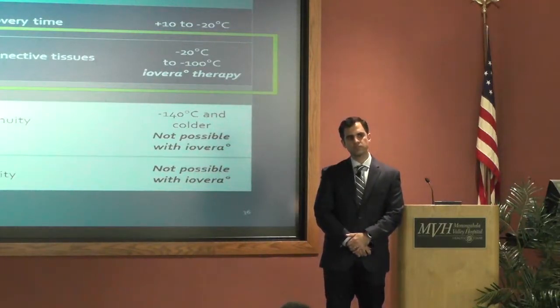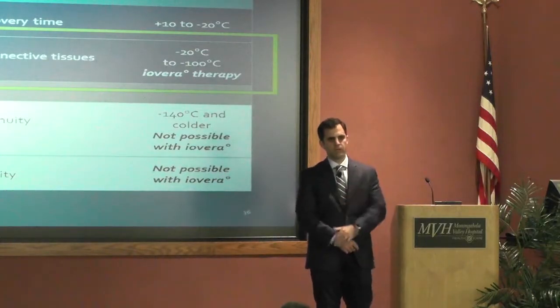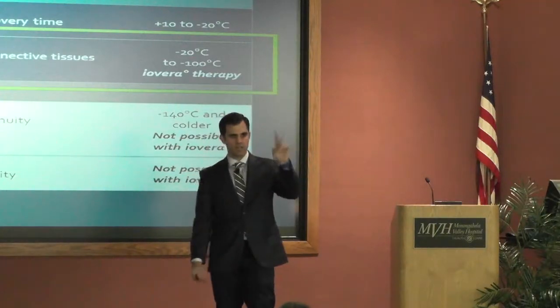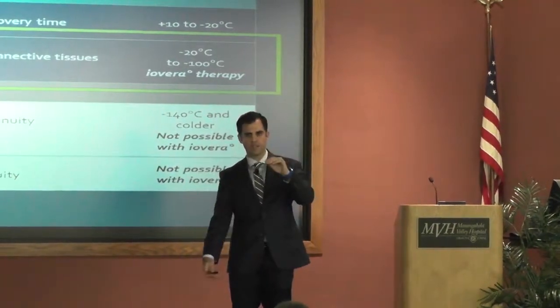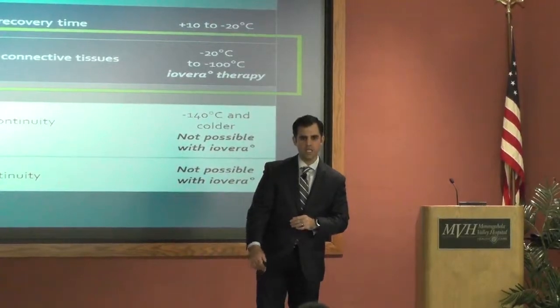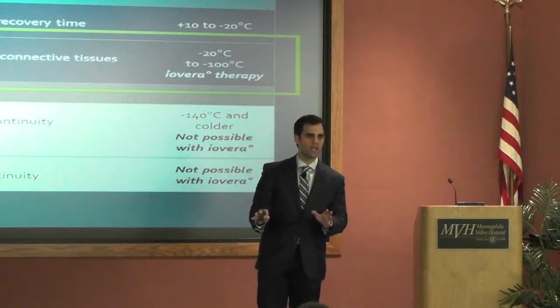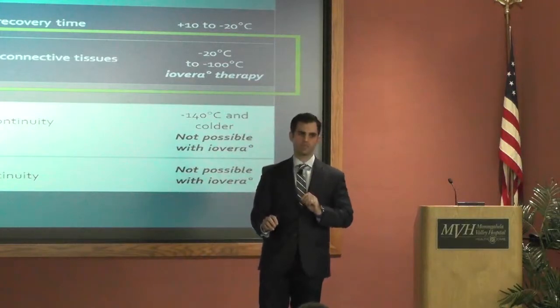When you do this treatment, does everybody get it injected in the same spot? You don't move it around? It's one spot for everybody? Yeah, everybody gets 2 treatment lines, the ones that I mentioned before. There's one above the knee and one on the inside part of the knee. Everybody's nerves go about the same area, but not exactly.